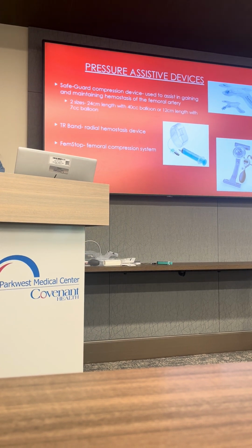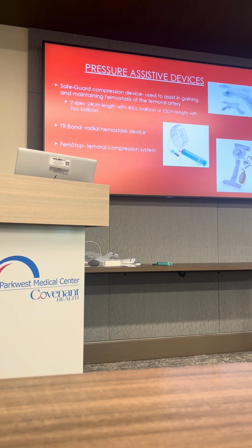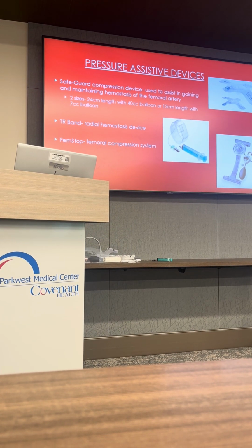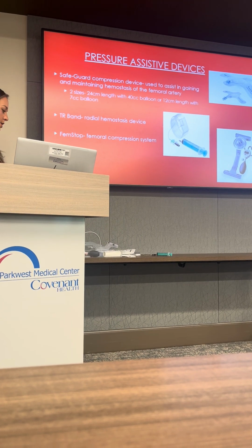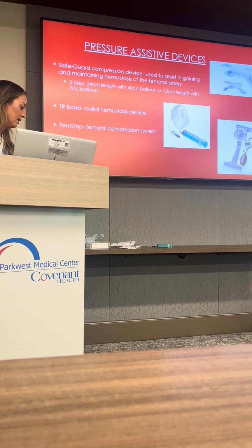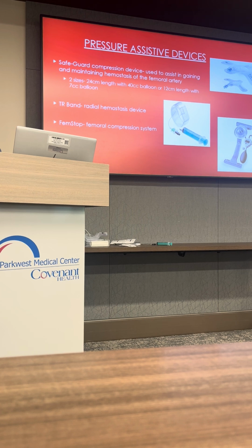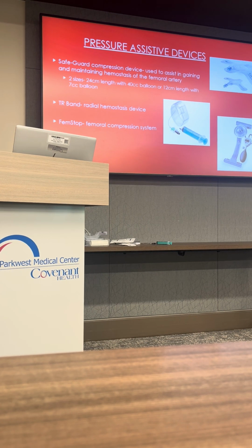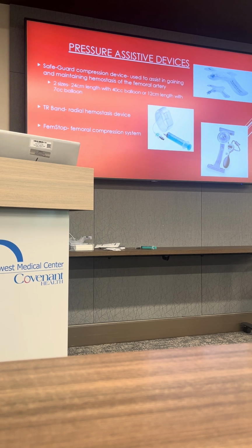But again, that needs to be something that's used with caution, not something that's just thrown around, used too often and not managed appropriately. Now, with that being said too, it's something that shouldn't be used for longer than a few hours at a time. You need to make sure that you're taking it off, that you're checking it, that you're releasing air from it pretty regularly, just to ensure that we're not putting any harm again to the patient.